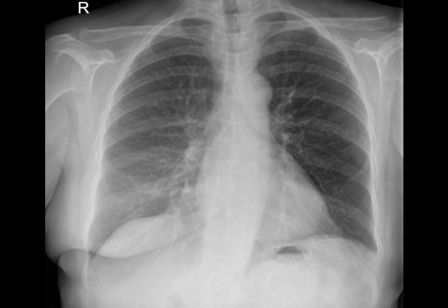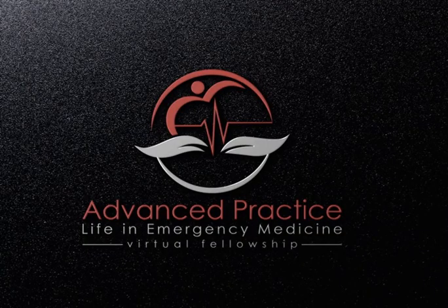So that will wrap up our systematic approach to interpreting a chest x-ray. Remember, using the same process every time will reinforce this until it becomes second nature.